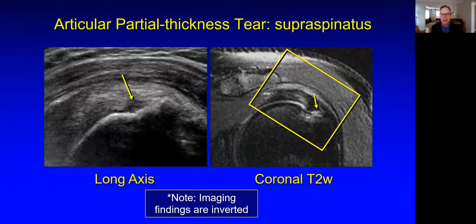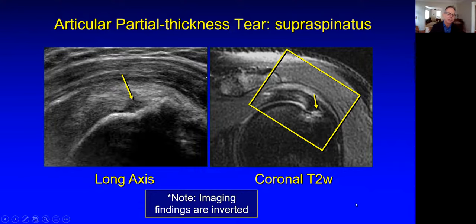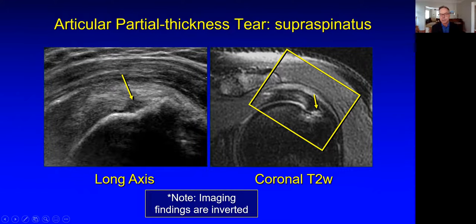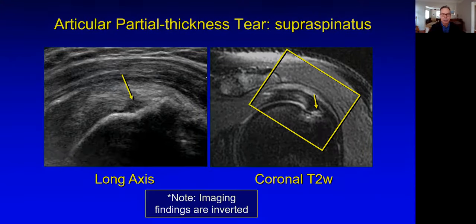Here's a partial thickness articular-sided tear. We see a well-defined defect touching the hypoechoic hyaline cartilage over the curve of the humeral head — therefore articular surface — not touching the bursal surface. Note here in the MRI, which is fluid sensitive, these images are essentially inverted: normal tendon is bright on ultrasound, dark on MR; the tear is dark on ultrasound, bright on MRI; the bone is bright on ultrasound and dark on the MR. When looking at an ultrasound image, you want to make it look like an MR image and vice versa. It's really the same pathology with ultrasound but higher resolution.